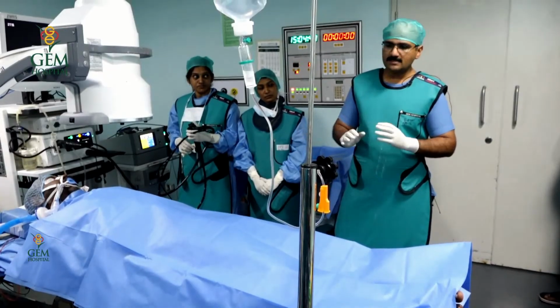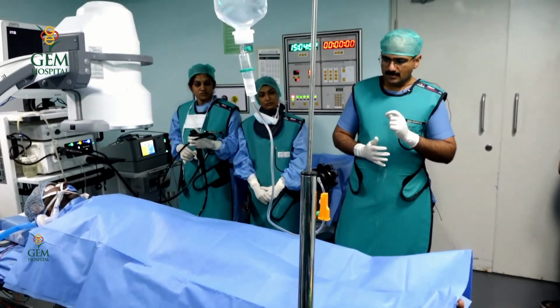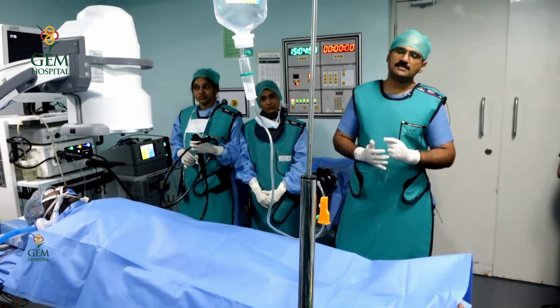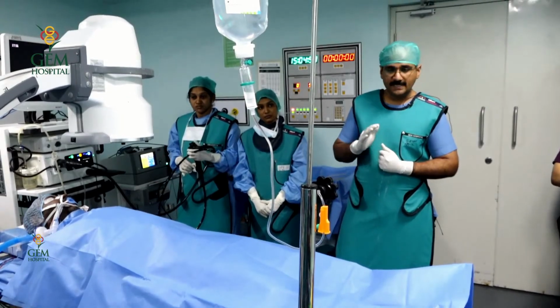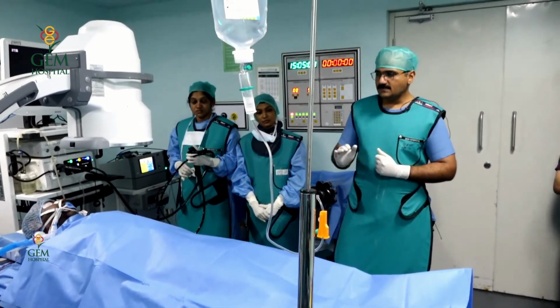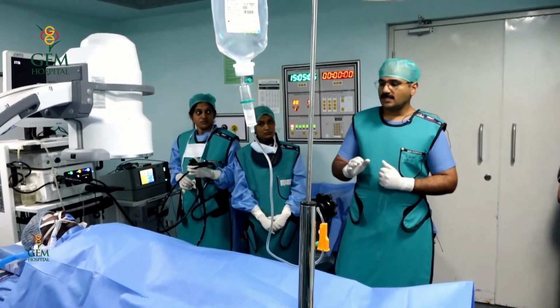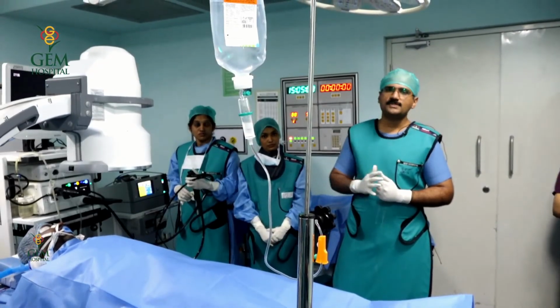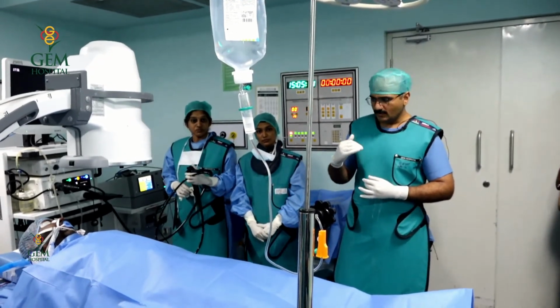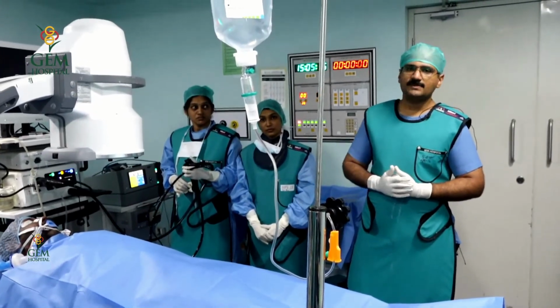Before we touch the case, whatever has been elaborated by Dr. Anaga, this is a small CBD stone at the distal CBD, and especially a post-laparoscopic cholecystectomy has been done for this patient. The first precaution we should take is to hydrate the patient well and to make sure we give a rectal diclofenac, which has been done, to prevent post-ERCP pancreatitis. So even before intubating, make sure these things are covered, and let's proceed with the case.